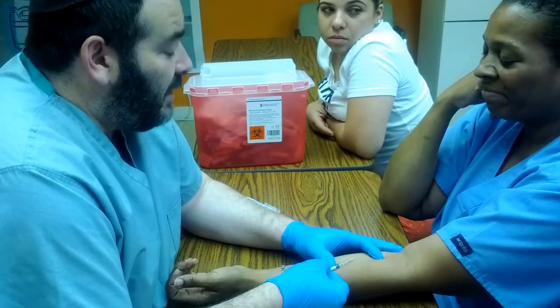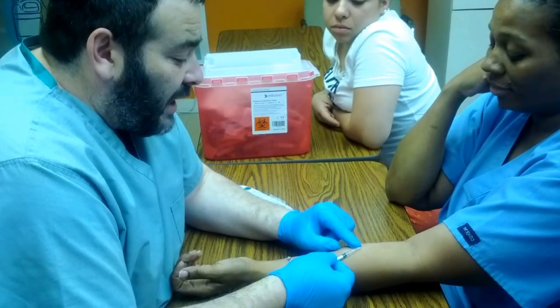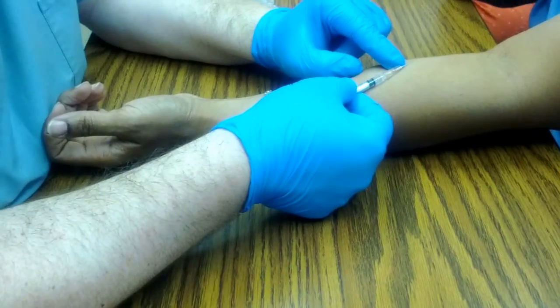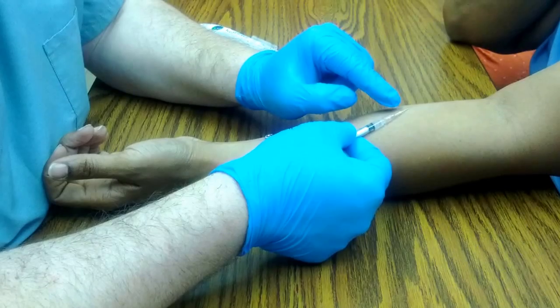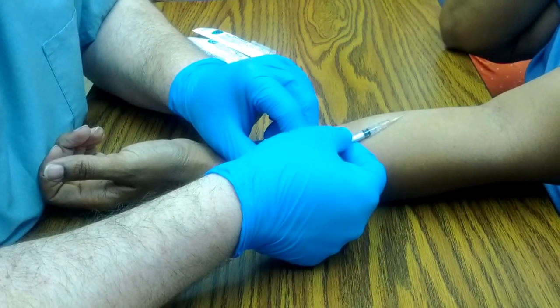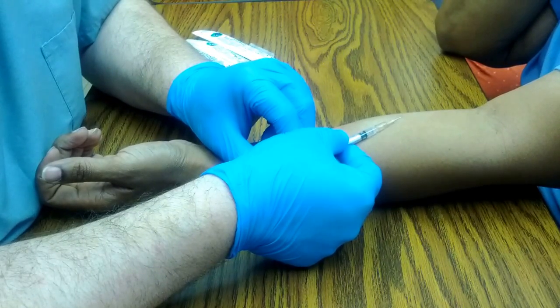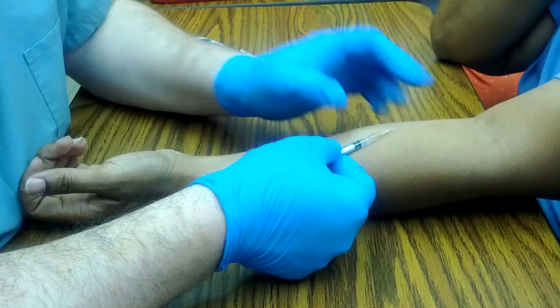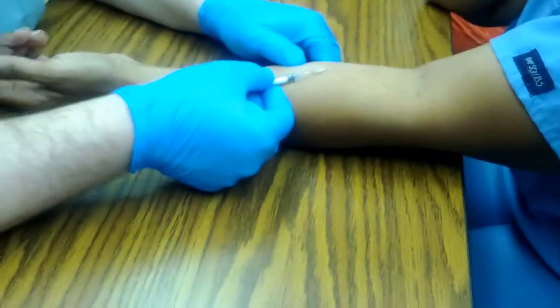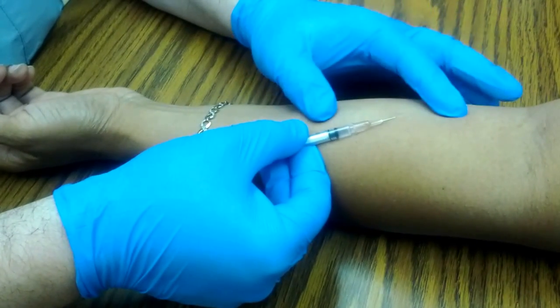Not too much pain now, is there? To see exactly where you are, all you have to do is lift the tip of the skin just like so — I'm lifting the skin right there. And then I can see exactly where I am, where my tip is. Ever so gently, I'm going to inject just a little bit. The water is bacteriostatic, so it burns a little bit — my apologies. You see the little bubble that formed over there? That's all I need to do. With a doctor, you inject the entire amount. As far as the class is concerned, only inject until the bubble is formed.